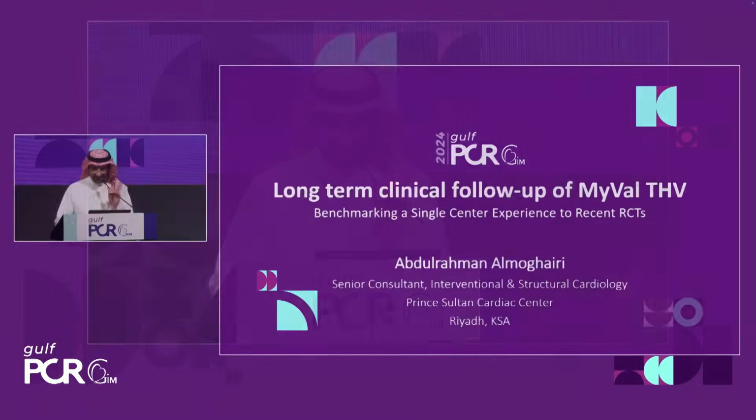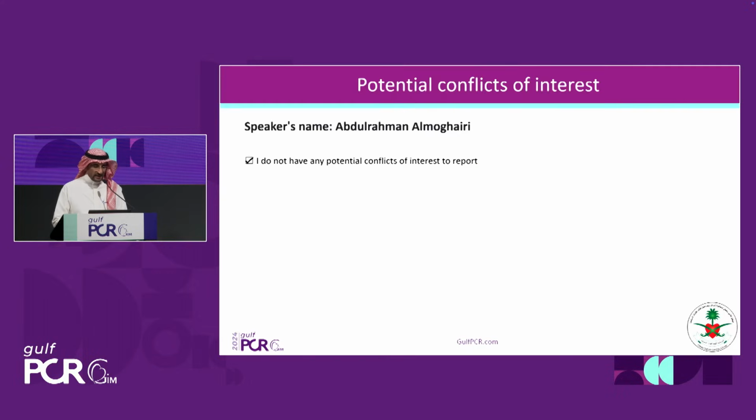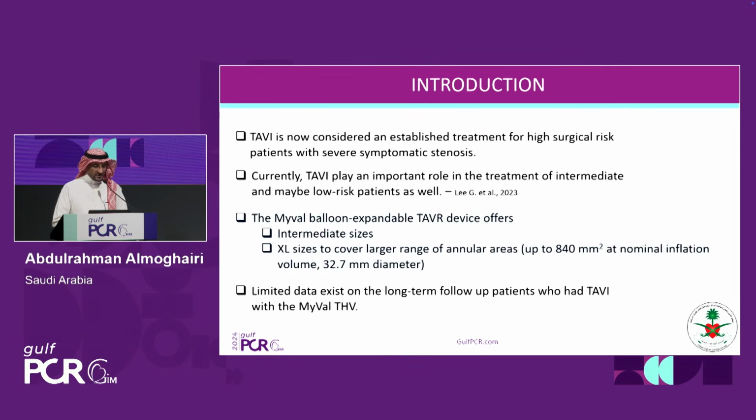Good afternoon. I will share with you our initial experience with the Myval valve. We started in 2019 with a few cases, and we have over 5 years of follow-up. Since transcatheter valve therapy started for high-risk or prohibitive-risk patients for surgery, it is now moving towards low risk and also a younger generation.